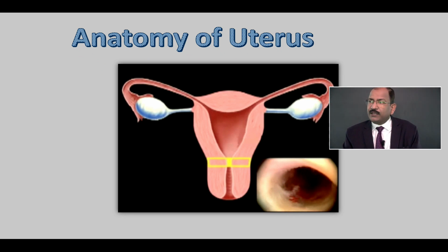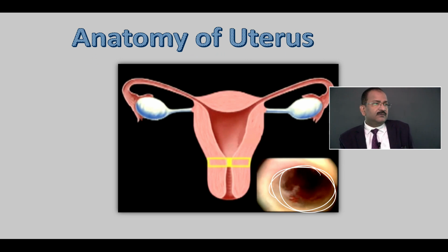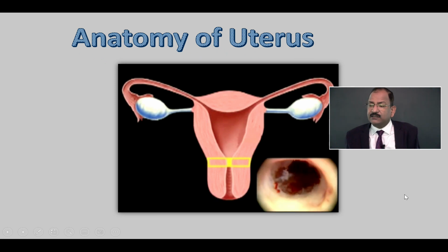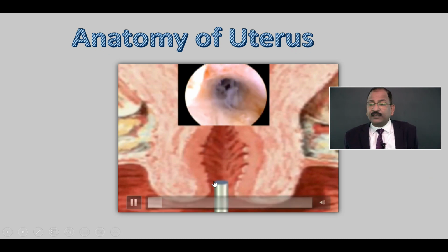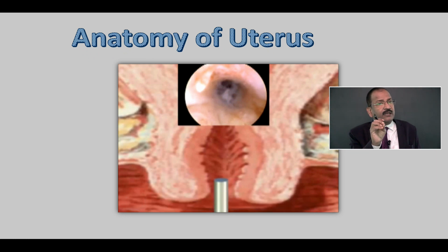Even in laparoscopy, you might have noticed that while you are introducing the laparoscope in the cannula, it shows you the wall of the cannula, not the tip of the cannula. So that's why many gynecologists in hysteroscopy use a 0-degree telescope to enter, so that entry will be safe and the black hole will be in front, and then they slowly keep on entering under vision. Once they enter the cavity, they change 0-degree to 30-degree. How? The sheath will not be removed, the sheath will be there; remove the telescope and change to 30-degree.